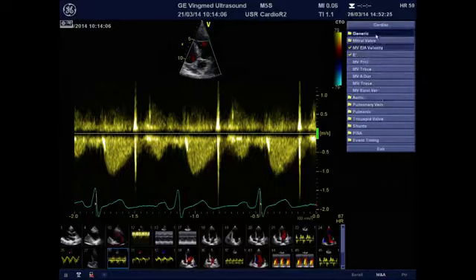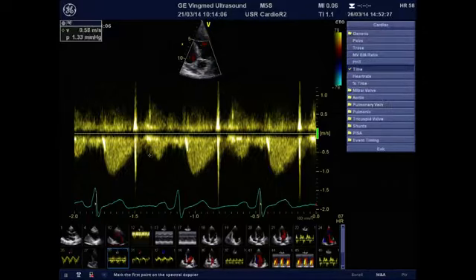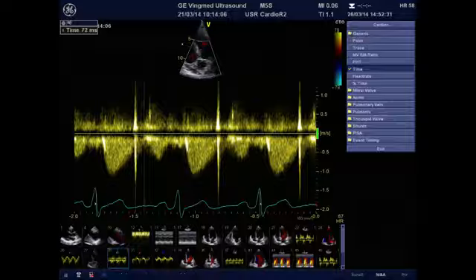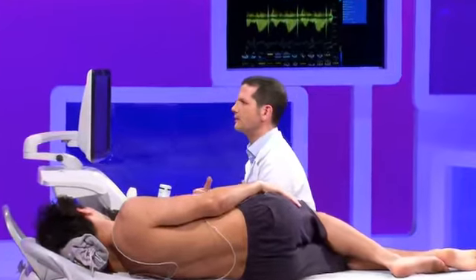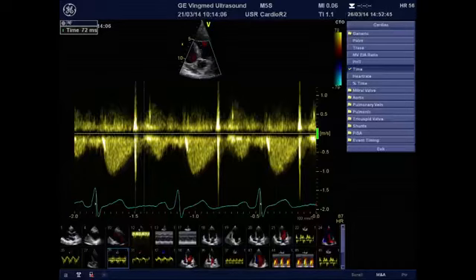As the name implies, this is a parameter which is a good marker of the relaxation of the left ventricle. The slower and the impaired the relaxation, the longer the isovolumic relaxation time. In other words, it will take longer before the ventricle relaxes and the mitral valve opens.